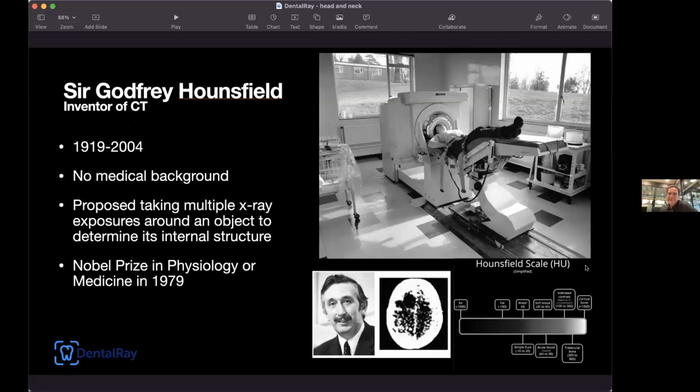Excellent, thank you. So this is the inventor of CT scans, and for the image that was acquired here, he proposed that, hey, we have X-ray, so we'll take multiple projections as we move around the head, and then we'll use mathematical computation to figure out the internal structure of the box or the head. One rotation took about 4 minutes, and the computational power in the 70s required overnight post-processing of that imaging to receive just one slice of a CT scan.